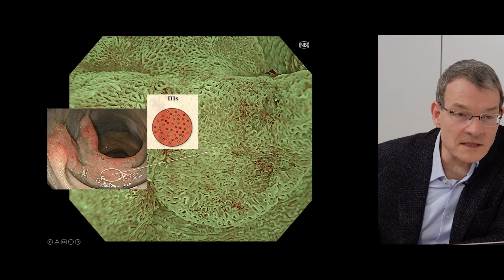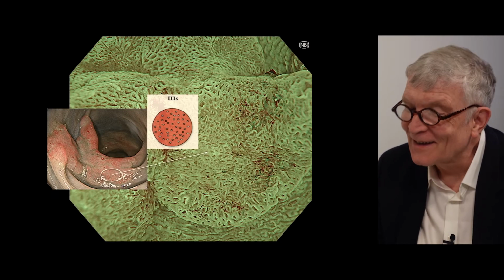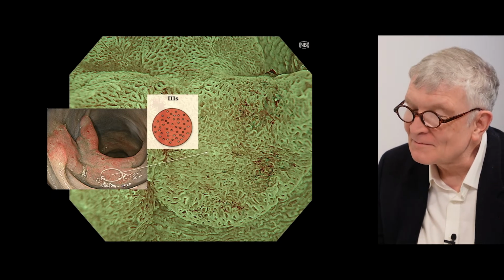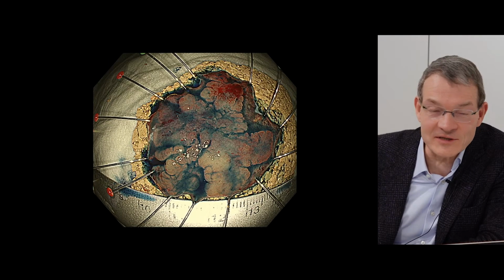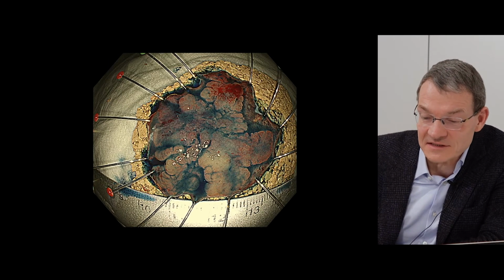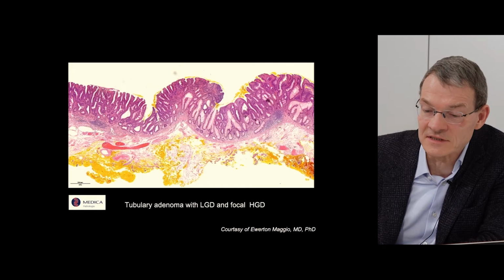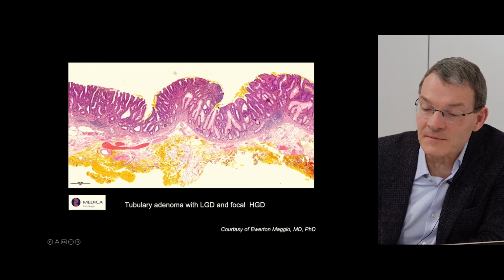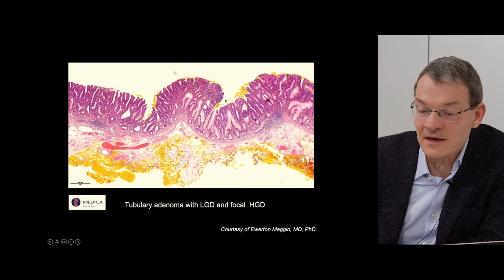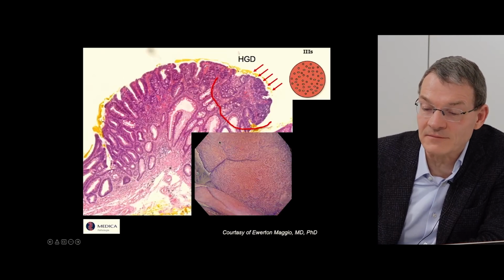Okay, now you will ask me, what is the consequence? Yes, of course. In this case, we performed an ESD. You did? And now the question comes to the pathologist, are there differences in these areas? And there are differences, interestingly. So in the area of this reddish mucosa, we have focal high-grade dysplasia.